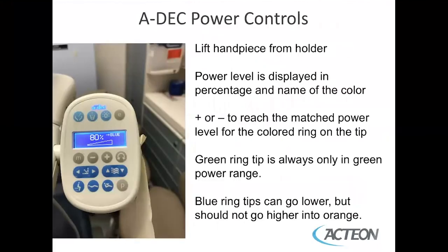When you lift the handpiece out of the holder, the middle section of the screen goes from the word 'ADAC' to displaying the power setting. For example, you can see it displaying 80% with the word 'blue' on the screen. This is displayed as a percentage and the name of the color. To adjust it, use the plus or minus to reach the matched power for that color ring. The green ring tip is always only in the green power range, and blue ring tips can go lower but should never go higher into the orange range.